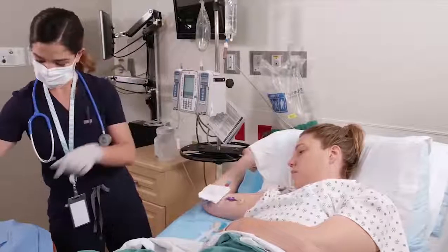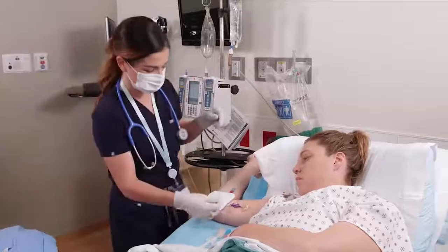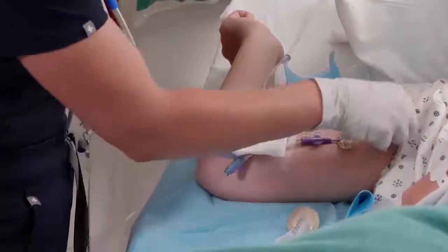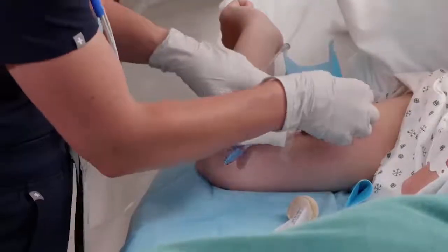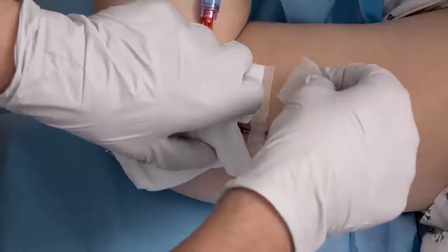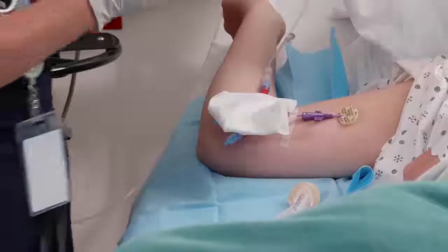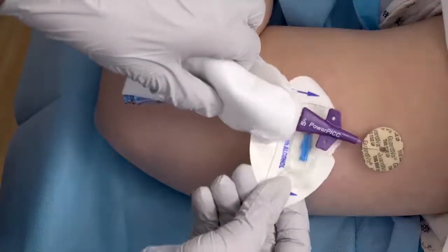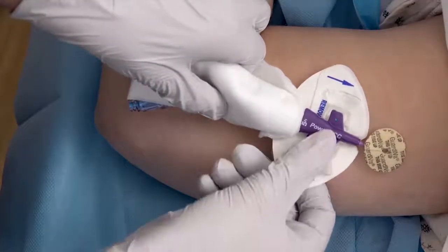Apply a skin barrier solution. Skin barrier should dry completely and not be tacky to the touch. Reapply the stabilization device according to manufacturer's instructions for use.